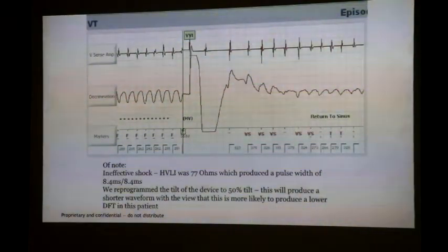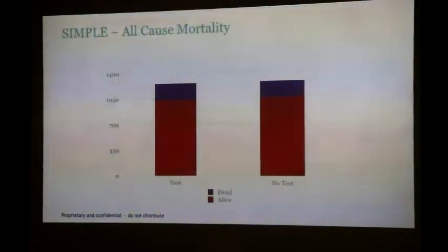But change where the lead is. Yeah, that's not going to change the shock impedance. It might change the effectiveness, but it won't change shock impedance. I'm sorry, sir, but if I have the tip of my lead in a scar, you have a high impedance. No. Why not, sir? It's fibrous tissue. No.